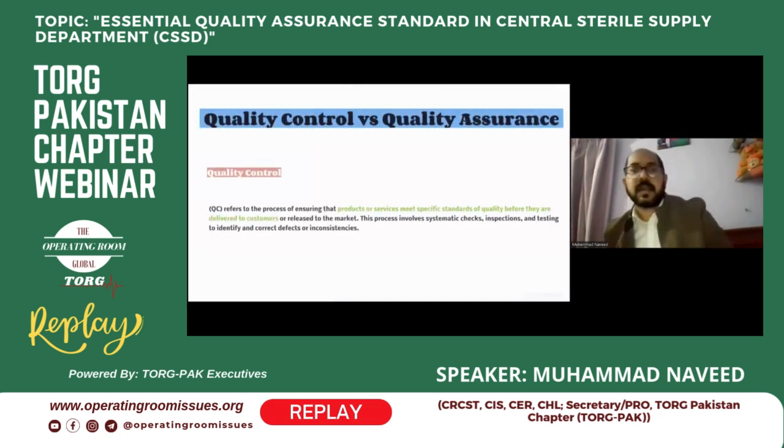First of all, it is mandatory to define the terminology we are using in our webinar. First are quality control and quality assurance. What is quality control? Quality control is used to make sure products and services meet the specific standard of quality before they are delivered to customers.